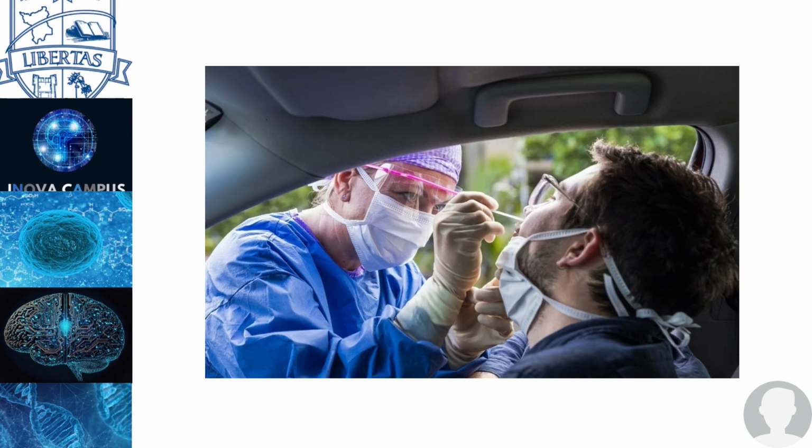And like I said, we used a lot of PCR during the COVID pandemic. It was largely used, and it was very useful for all of us. Thanks to PCR, we could diagnose people. We saved a lot of lives through the use of PCR. And again, they will use a nose swab, like you're seeing the lady right there sticking the nose swab in that dude's nose, and collect the DNA sample and just run the test.